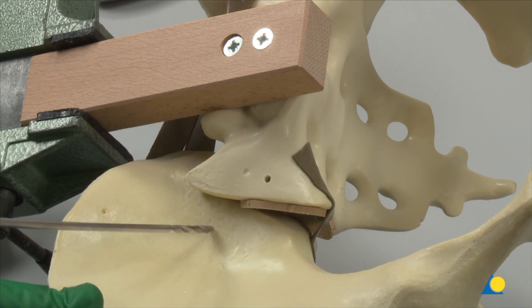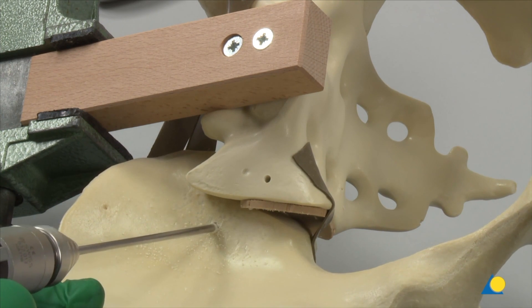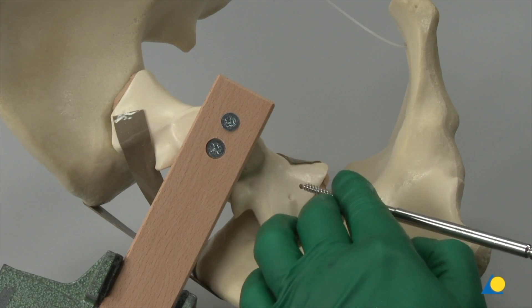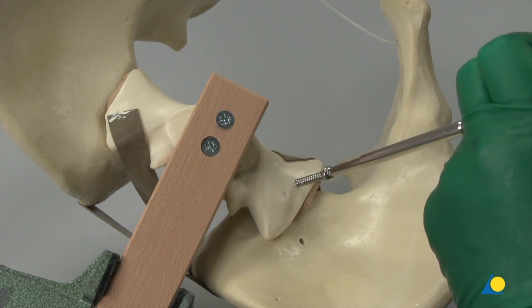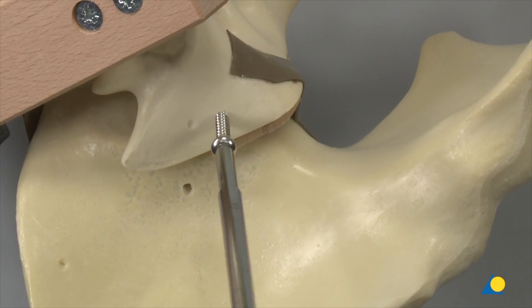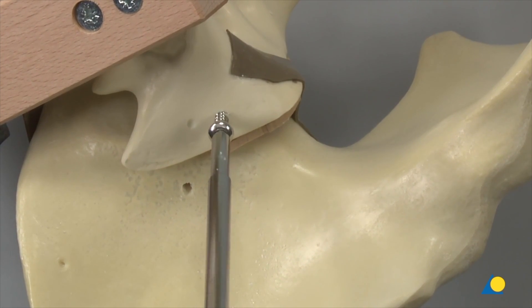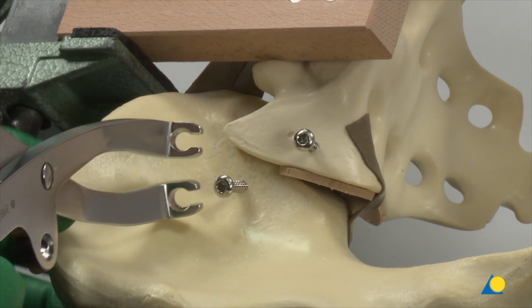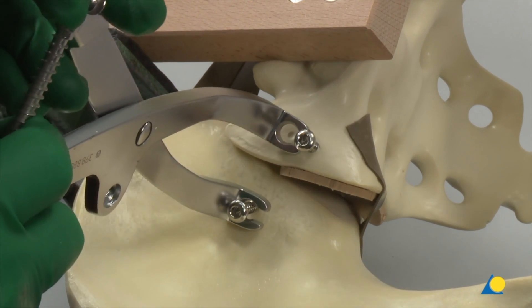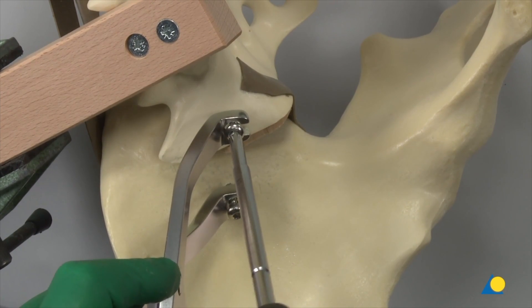Make a second hole in the iliac bone close to the sacro-iliac joint. Insert two 4.5 mm cortex screws of appropriate length. Leave the screw heads 5 to 7 mm prominent of the bone to allow the Jungblut clamp to be mounted. Position the Jungblut clamp on the screws.